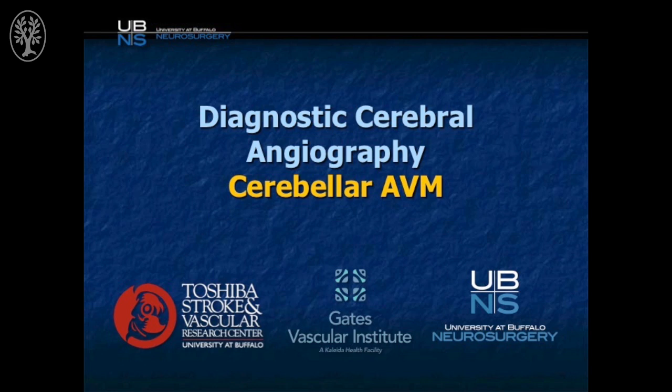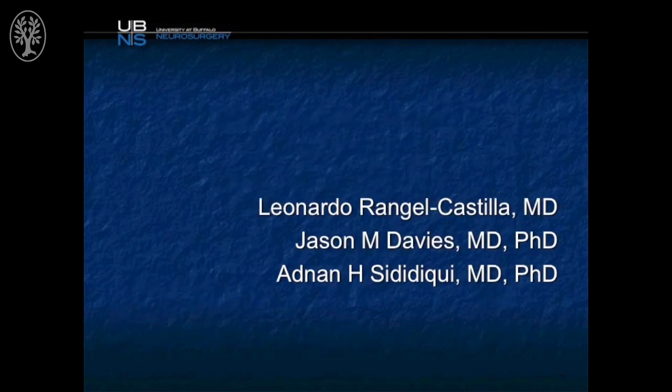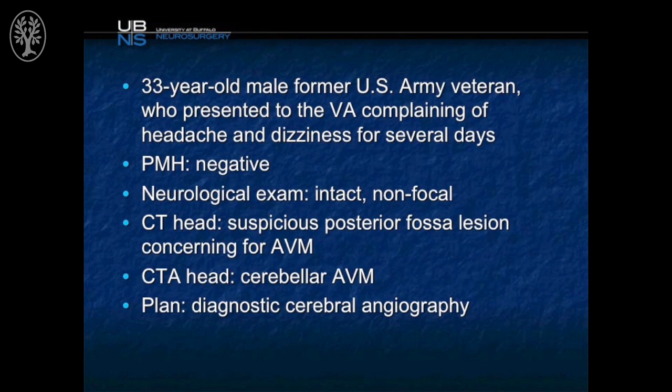This video will demonstrate diagnostic cerebral angiography, specifically showing technique using an angled diagnostic catheter. This is the case of a 33-year-old former U.S. Army veteran who presented to the VA complaining of several days of headache and dizziness.